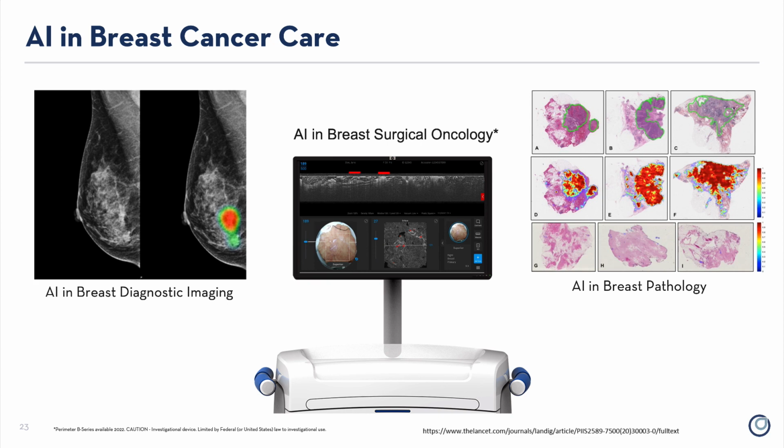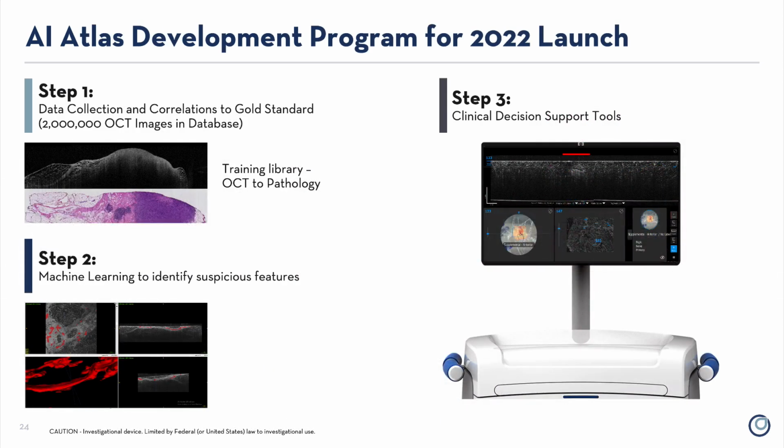Looking forward, with the introduction of OCT for margin visualization, a similar approach to AI will unfold. As OCT data sets grow and clinical trials produce evidence to support this technology, we will see AI assisting our surgeries in the not too distant future. When developing AI for OCT imaging of breast tissue specimens, the high-level approach is as follows.